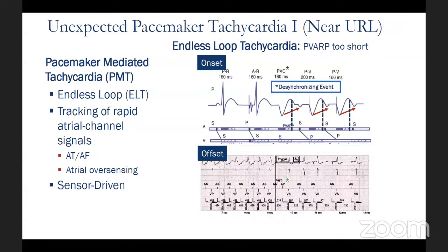And the second question is, I was on call last night and a lady came who has an ICD, who came in with appropriate shocks. Now, along the same line as your discussion just now, she has an abandoned lead. But for some unknown reason, don't ask me why, she never had a cardiac MRI before she had her ICD inserted.